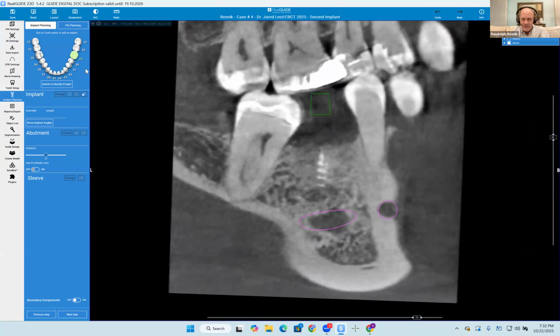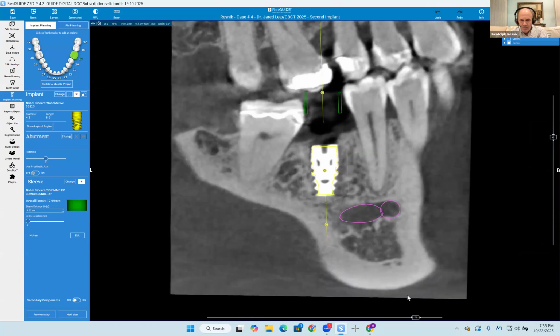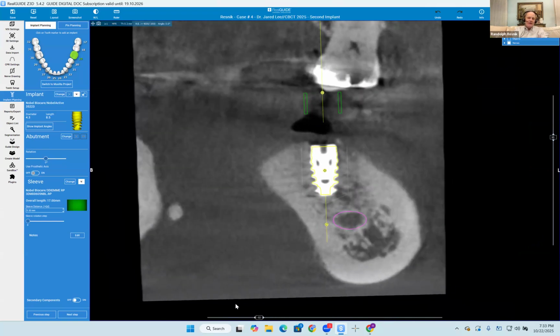Okay, go ahead, scroll through. Let me see this. This is the one we'll be taking out tomorrow. Okay. I would check, Doc. You might have something else going on here.